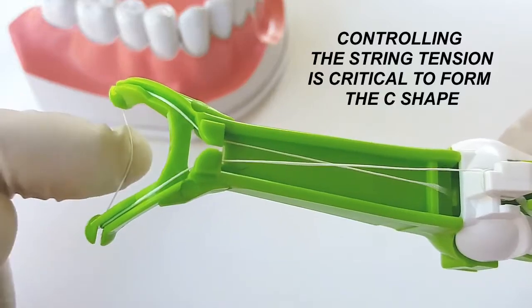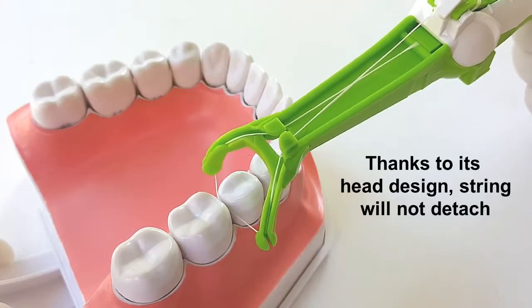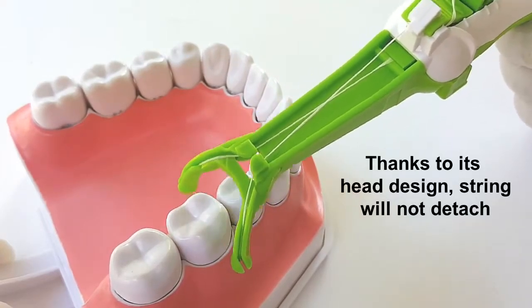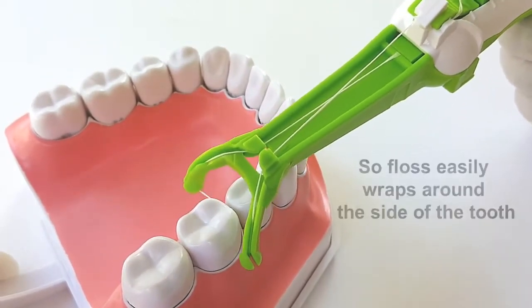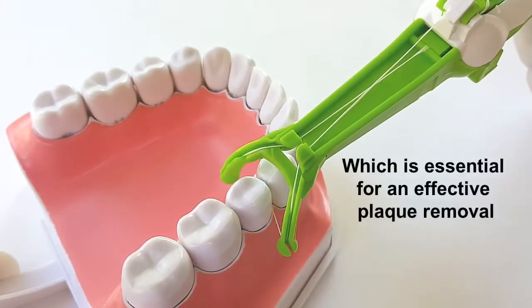Controlling the string tension is critical to form the C-shape. String will not detach thanks to its head design. Floss easily wraps around the side of the tooth, which is essential for effective plaque removal.